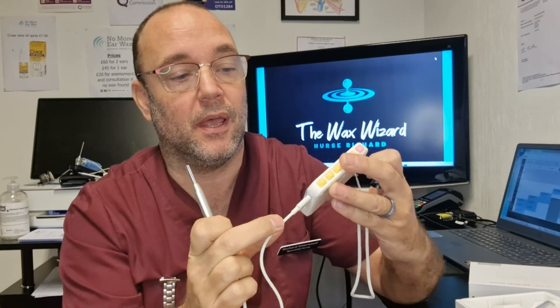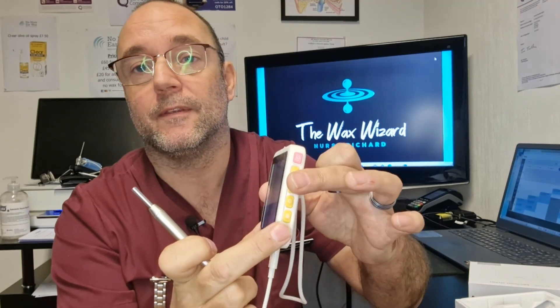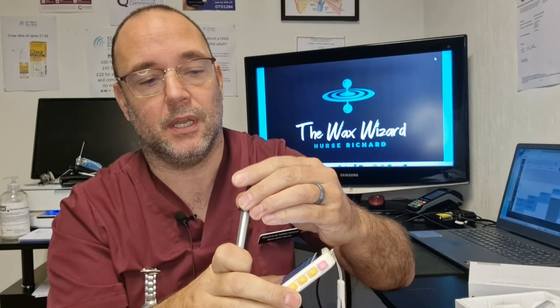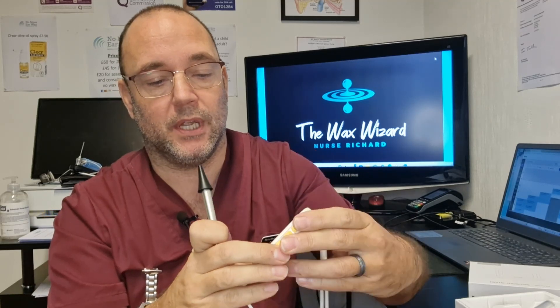Let me show you how easy this is to set up. There's the camera — literally just plugged it in, turn it on. There's a button there where you just turn it on. And those LED lights help to illuminate the ear canal. It's a 3.9 millimeter HD camera, and those LED lights give you a nice illuminated image of your ear canal.